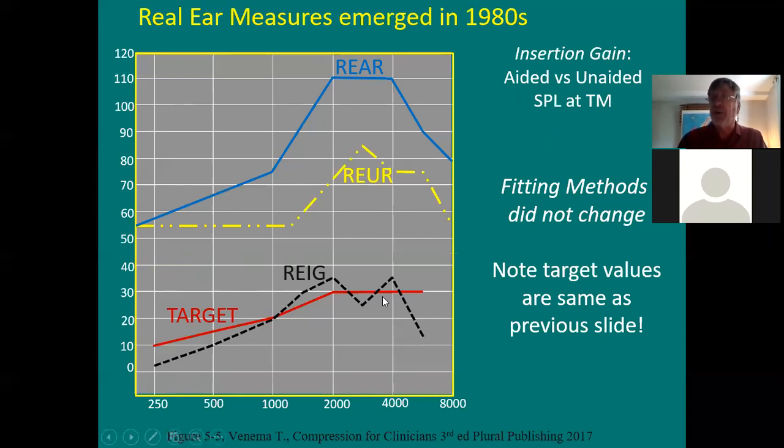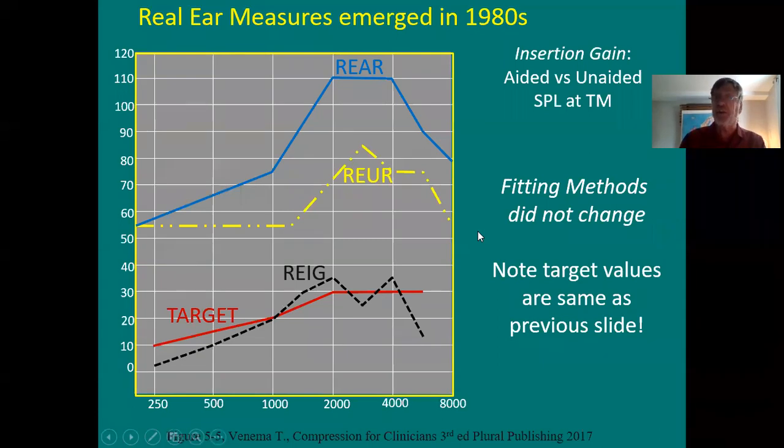Nice video game, but I don't know what it really tells. So in a way, this was no real improvement. The best thing about this was that it was quicker than doing this. Okay? But other than that, it didn't talk too much. Besides, you're using real ear unaided response when you didn't use it in a hearing test because you had the ear plugged. And remember, real ear unaided is the open unaided ear canal resonance.